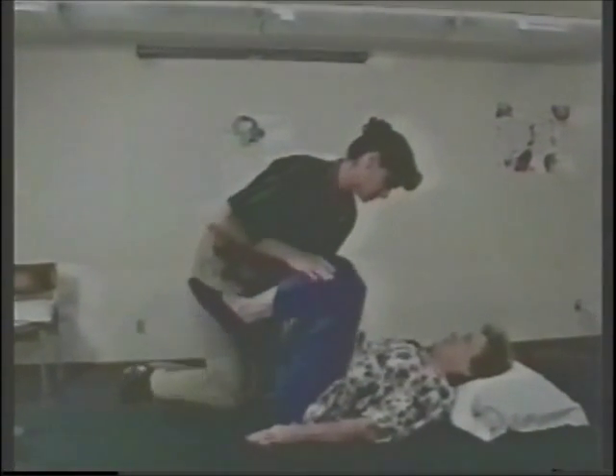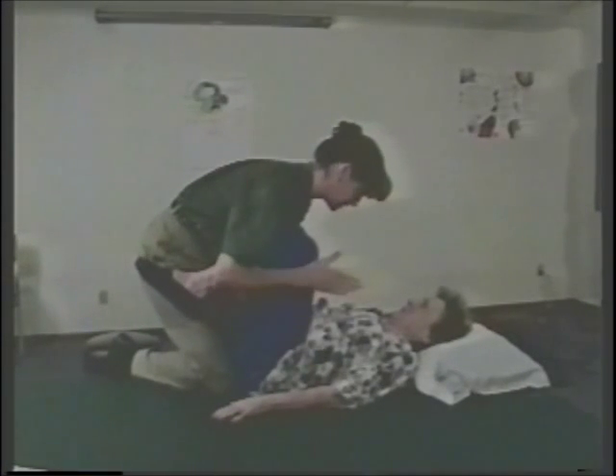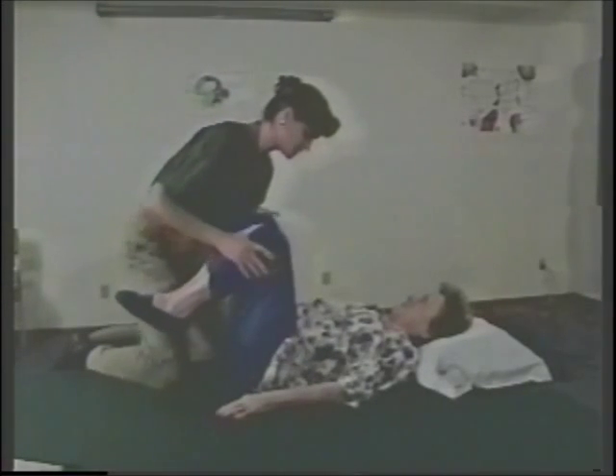I'm going to have you bend your knees, and I'm going to bring your hips forward and lift your hips up — I'm looking for symmetry and any fixed contractures. Relax, and I'm going to move you a little bit each way, looking for anything that's fixed or flexible, any tightness. Putting my hands behind her pelvis and pulling — you can see the movement in her pelvis, which shows that she has anterior pelvic tilt as well.